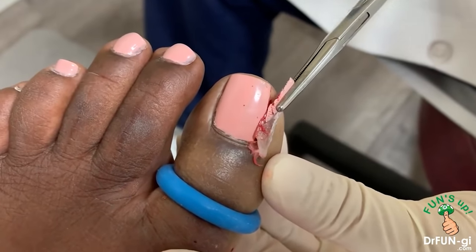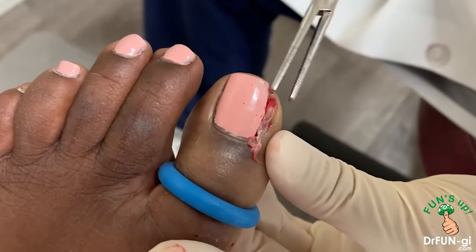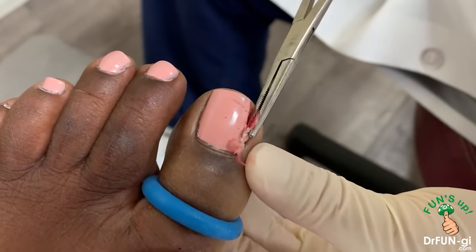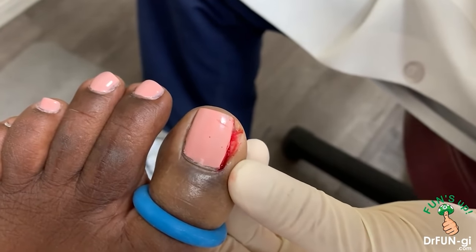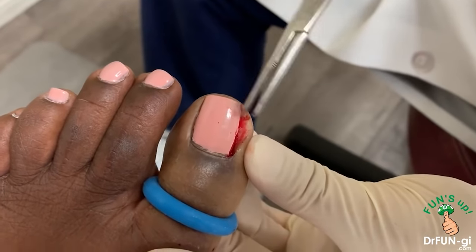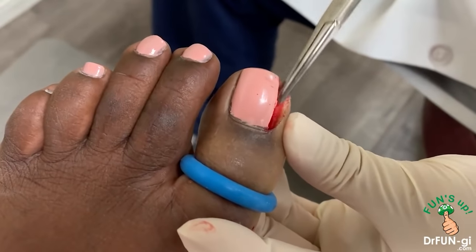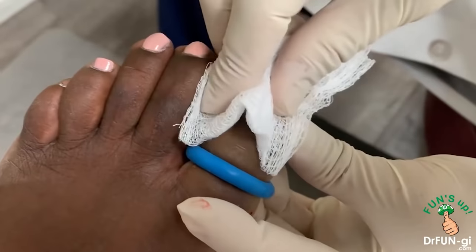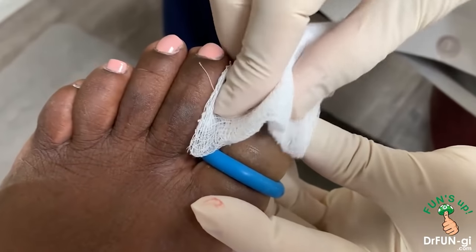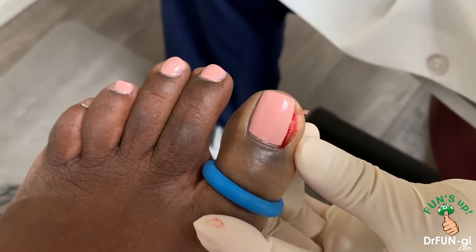The skin needs to be removed because we want the area to drain out, and we don't want any infection from there. So all of that is out, and I make sure that everything's out of there so it's really clean and nice.